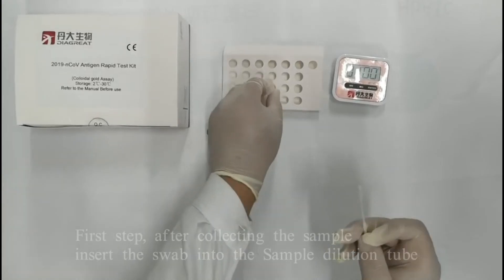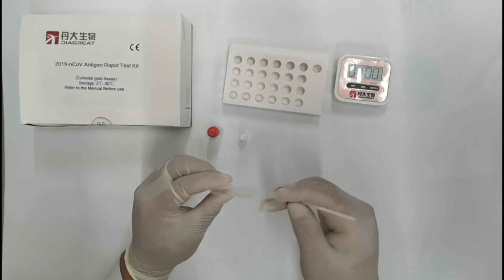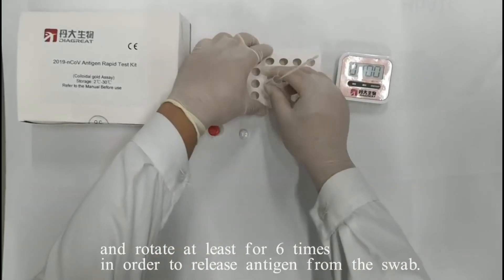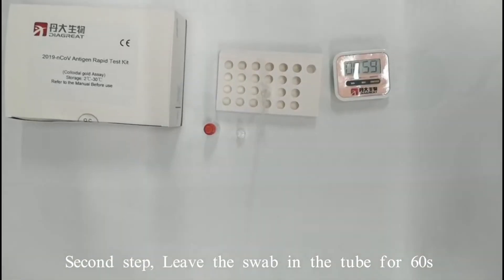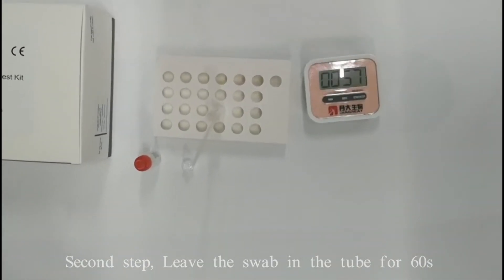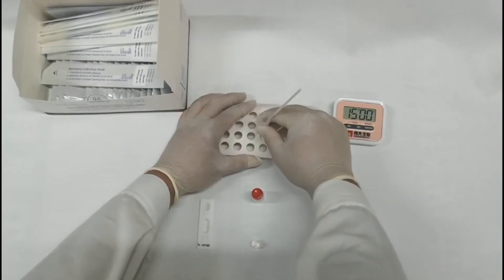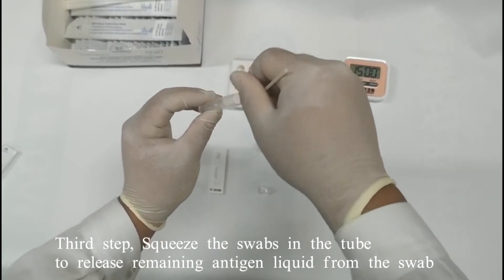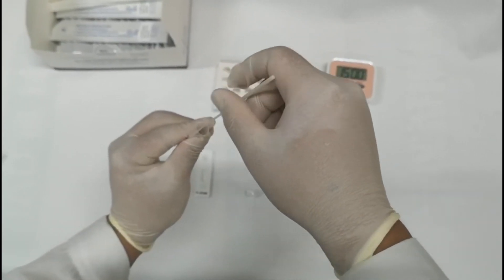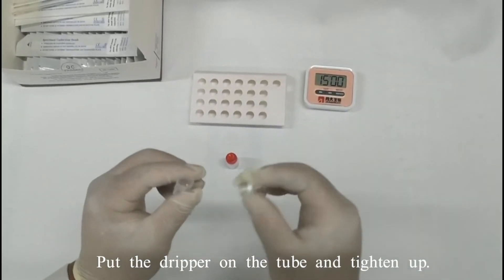First step: after collecting the sample, insert the swab into the sample dilution tube and rotate at least six times to release antigen from the swab. Second step: leave the swab in the tube for 60 seconds. Third step: squeeze the swab in the tube to release remaining antigen liquid. Then put the dripper on the tube and tighten up.